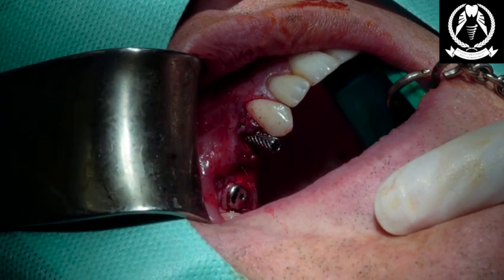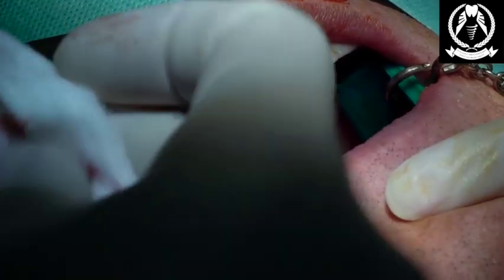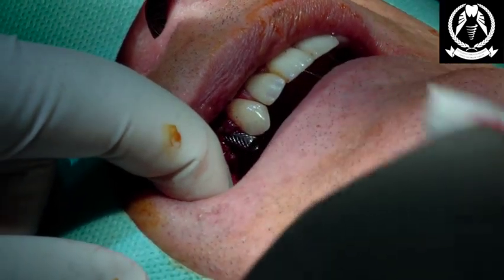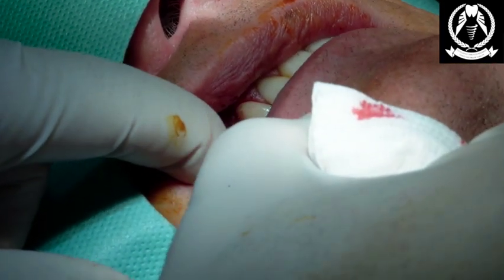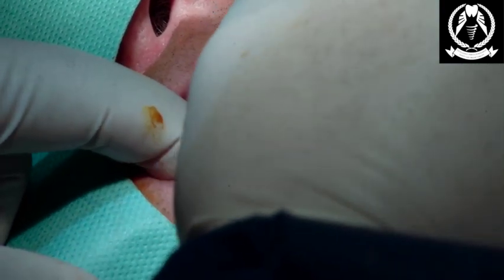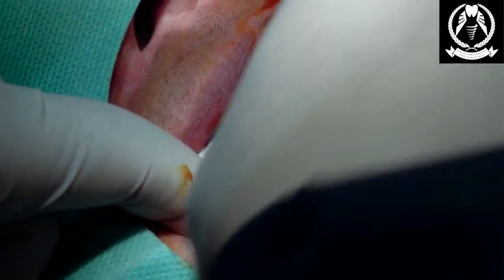All done. Okay. So, Alan, that side's all done. Your sinus lift is all done. Very happy with that. And that's going to come out. Great. And bite together for me, sir. Good. Open. I'll move that out of the way, but I want you to bite on this gauze for the minute, okay? Open wide. Great. And bite.